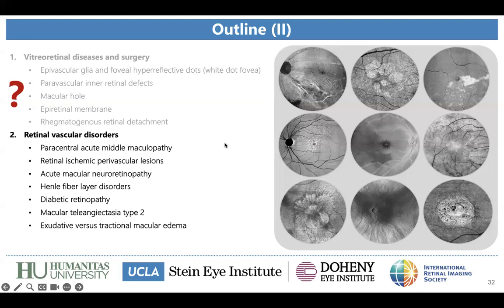Well, Alessandro, you made a great assembly of so much information and applicability and great images.